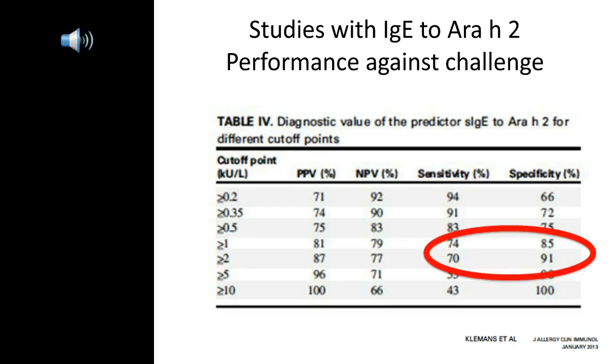So you'll still have people who react below the cutoff, but fewer. The trouble is what you need clinically is down to 10 or 5%. You really need to reduce the figure of those who react below that cutoff for it to be useful. So it helps, but it doesn't completely eliminate those people who will react and are below the cutoff.